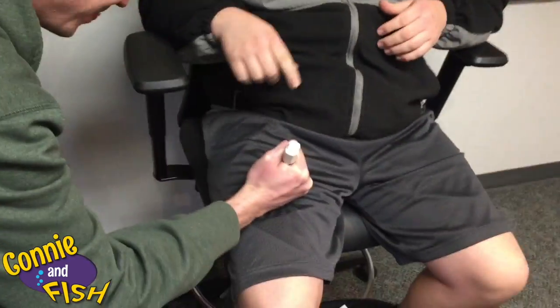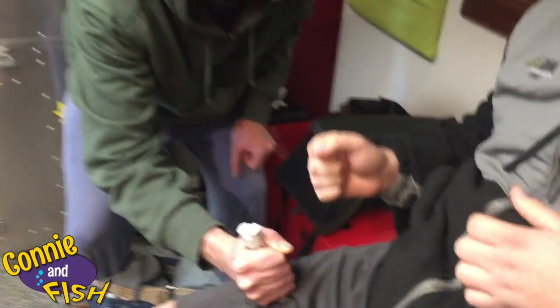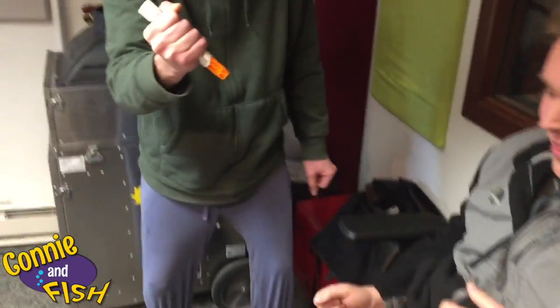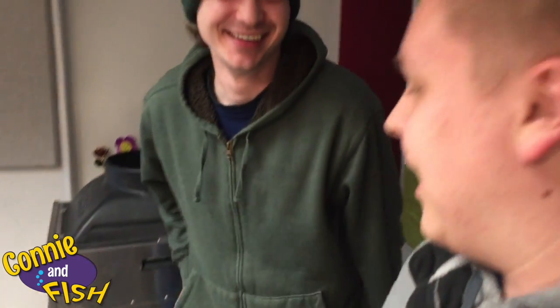Hold it there for ten seconds so all of the medicine can get transferred into the body — that way they can actually save their life. And ten! That's all you have to do, and then you call 911 immediately. If they don't get there within ten minutes, hopefully they have another EpiPen so you can give a second dose.